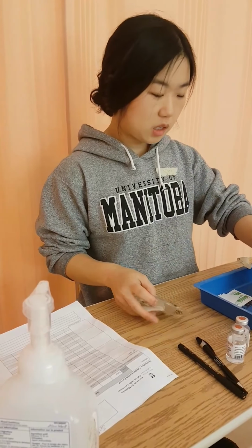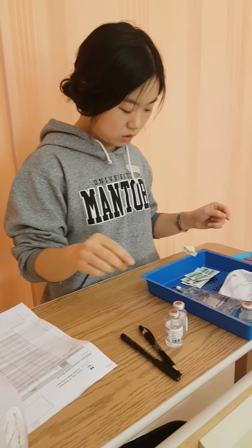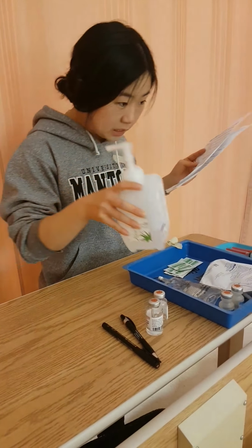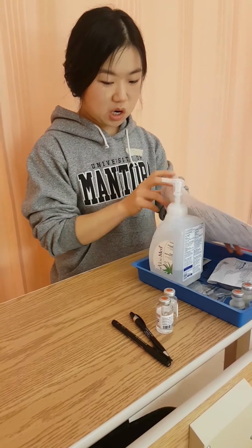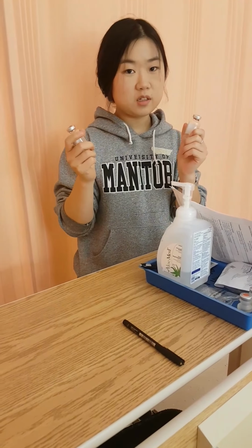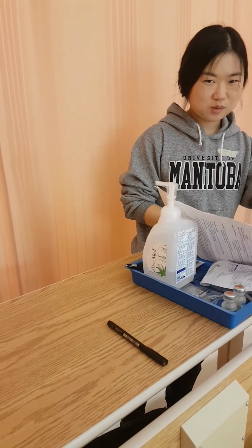So my secondary medication set, my mini bag, alcohol swab, and my label for the secondary line, hand sanitizer, my MAR, and a pen. And then this, I don't want to leave it unattended, so I'm going to put this in the med supply room. So I put it in the med supply room.